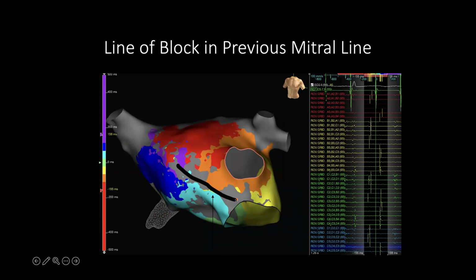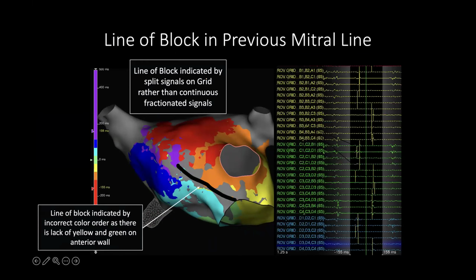And I correlated the history of the patient. This patient already had an anterior line of ablation performed for another kind of left atrial flutter. We can see the signals are separated from each other. There is no continuity in the signal. And also the activation mapping suggests that this is the reentry circuit. It's going through the lateral mitral wall, then around the mitral annulus, coming up in the septum, through the roof, and then back again through the appendage, basically. Very cool case.